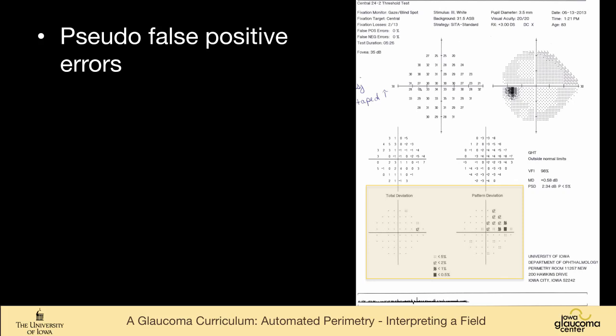Having said that, I don't want you to throw away every field in which there is a disconnect like this because occasionally, and to me it's a very small percentage of the time, you can have somebody who has real disease who has this same disconnect between total deviation and pattern deviation. And these are the people whose vision is extraordinarily good. People who have 20/10 vision, if they have a defect in their visual field, it still may be normal for age, but it's just abnormal for them.